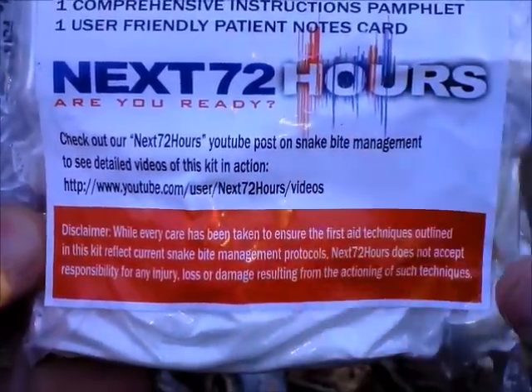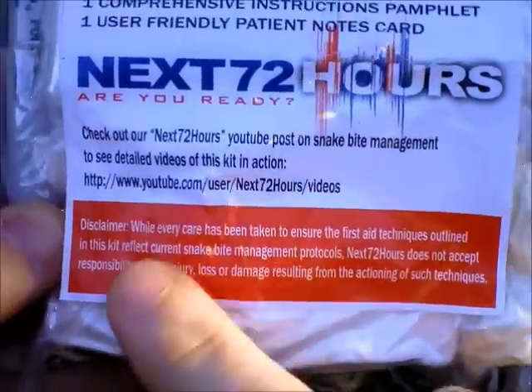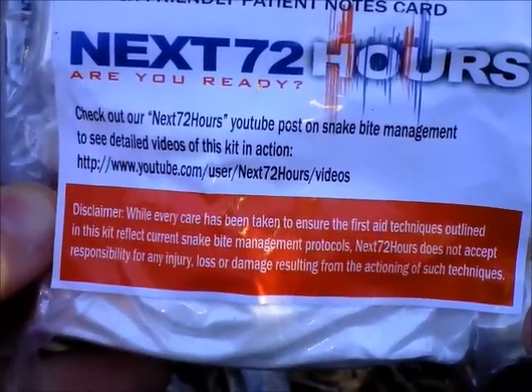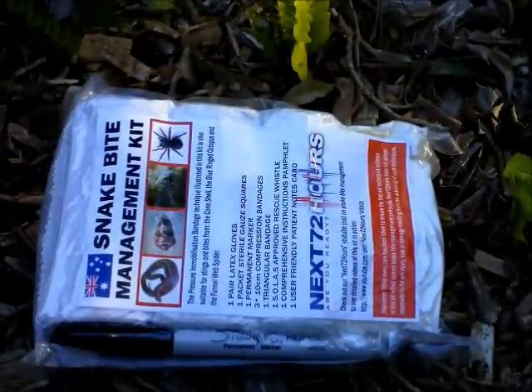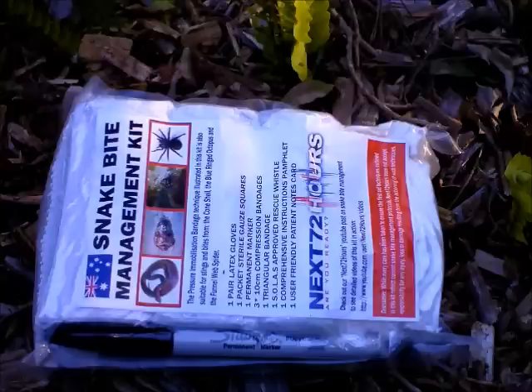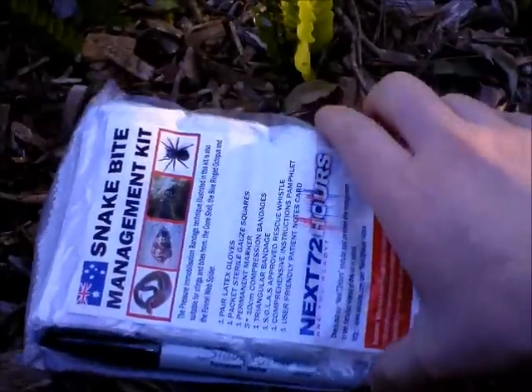Down here you'll see information on where you can go to view the videos we've done on this — there's actually a video on the Next 72 Hours YouTube site where you can see this kit in use. There's also a disclaimer noting that a lot of effort has gone into making sure this reflects current snake bite management protocols. However, it is important that you, as a person carrying this kit, should be well trained in first aid. It's vital that if you're going out somewhere remote, you know what to do with the equipment you've got. It's really no use pulling out an instruction manual when someone's been hurt — that's just going to delay treatment and increase the chances of things going wrong.